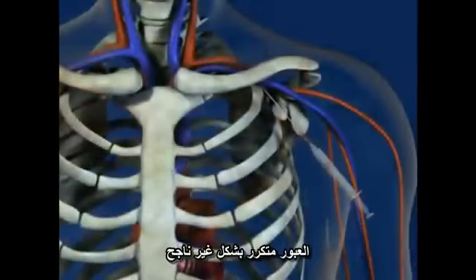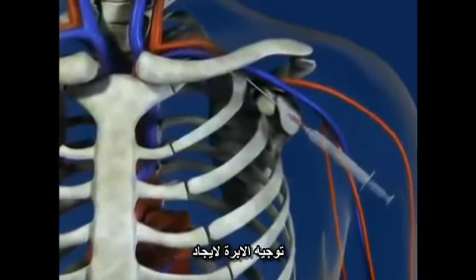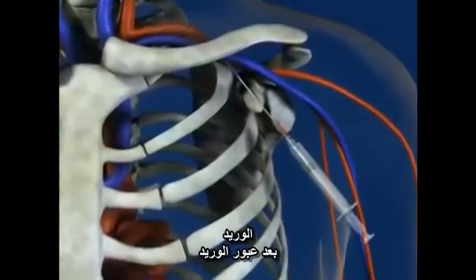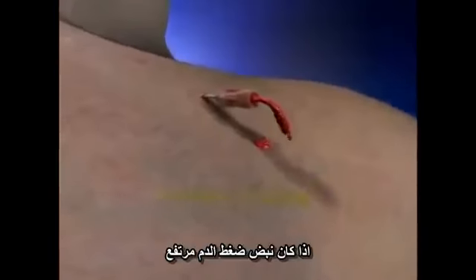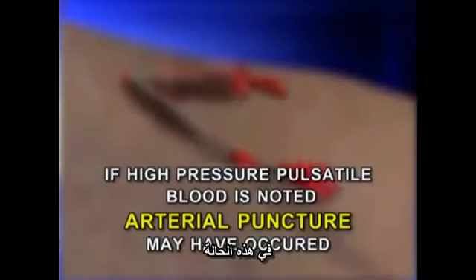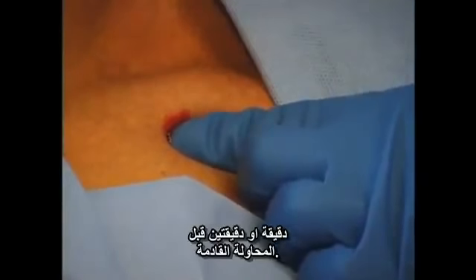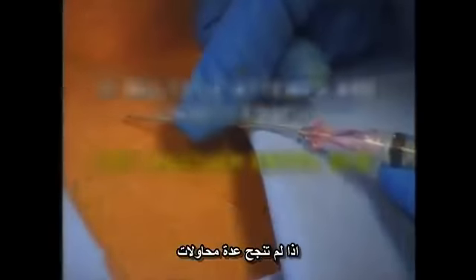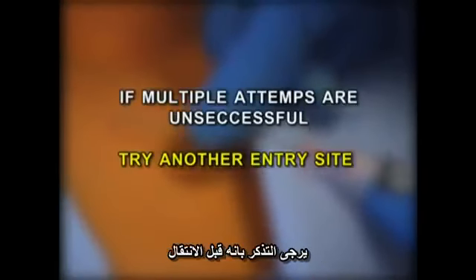If this is unsuccessful, repeated passes are attempted with slight changes in the orientation of the needle to find the vein. After accessing the vein, the syringe is removed and the backflow of the blood is observed. If high-pressure pulsatile blood is noted, arterial puncture may have occurred. In this case, the needle is withdrawn and pressure is held for 1 to 2 minutes before the next attempt. If multiple attempts are unsuccessful, it is often wise to try another entry site.